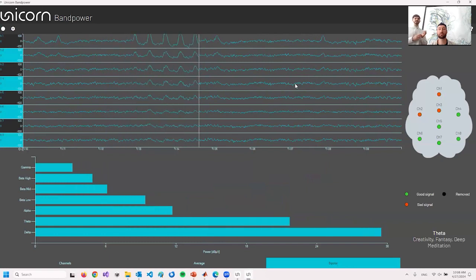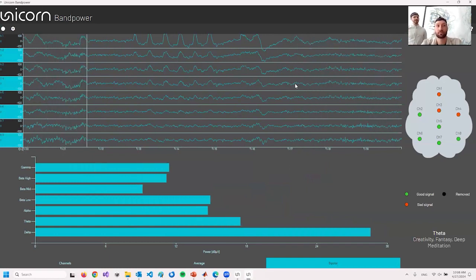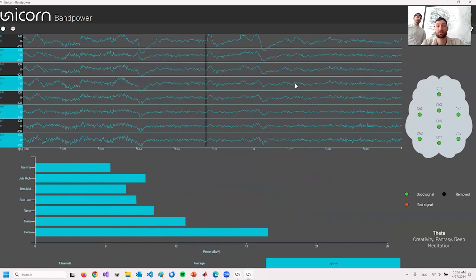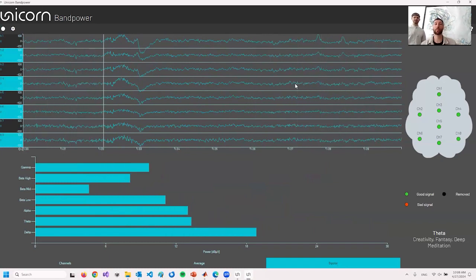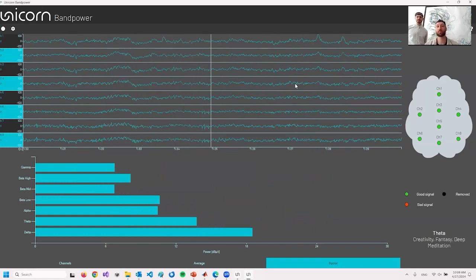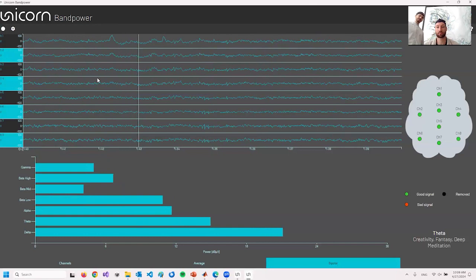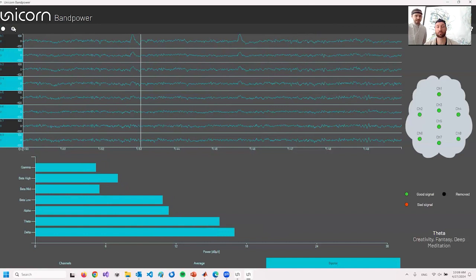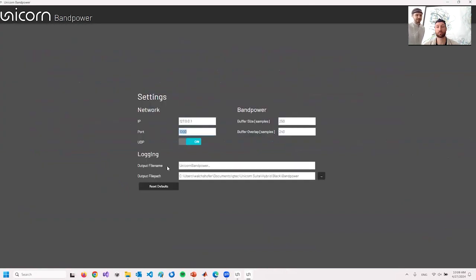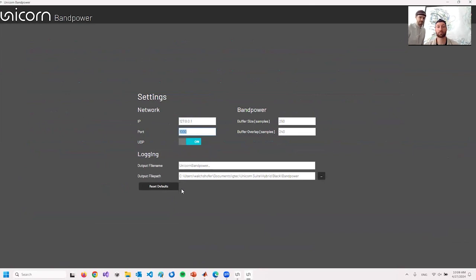You could average sections of the signal and calculate the mean, check if you can trigger a rise or a fall in a specific frequency band. You can measure some biomarkers like alpha theta ratio or beta gamma ratio or whatever band power based biomarker you want to acquire. And you can not only visualize data within this tool, you can also stream data out. And therefore we have a UDP interface. You can set the network settings in here. And if UDP is enabled, you can receive data via UDP.